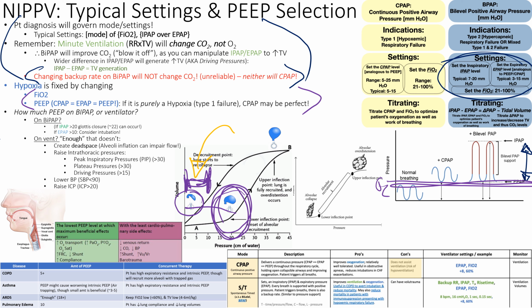Okay, so we want what's called an optimal PEEP, right? You don't want too much, that can cause problems too. But we want an optimal PEEP. Don't let anything get less than this PEEP or this EPAP, or this CPAP. Those are all the same things.